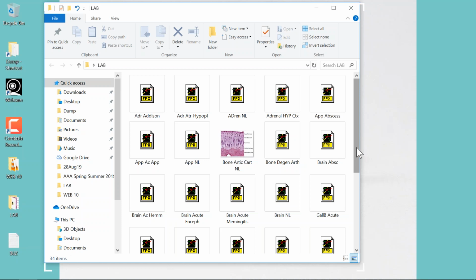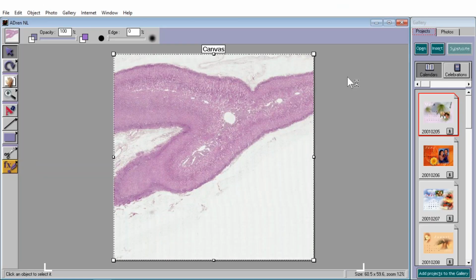Because I labeled these slides alphabetically, it looks like the first thing we're going to be looking at is something called ADR. Up there I put ADRE, there I put adrenal. So let's start out by looking at a normal adrenal gland. What you see now looks like a T or maybe a bird flying, and you can see it has a darker edge, some connective tissue. Then there's something very, very vascular in the middle, like the adrenal medulla. And then you see some changes within this thicker cortex.